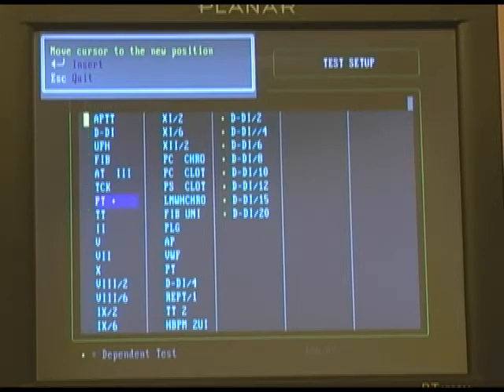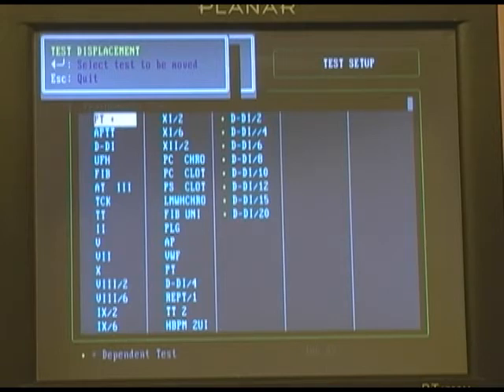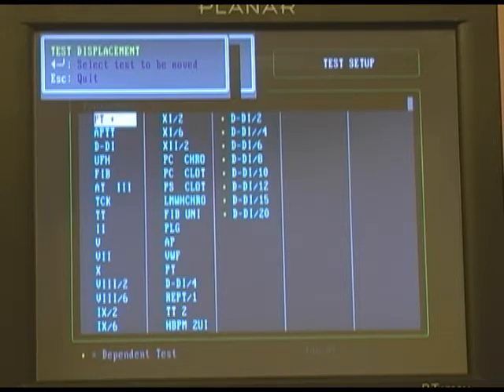We're going to put PT at the very front of the list. So we've highlighted it, press Enter, move it to the desired location, and hit Escape — and now that test will appear as the very first test on our test panel screen. You can do this with any of the tests.